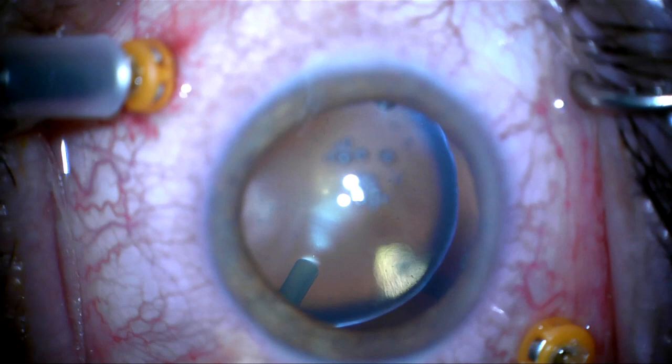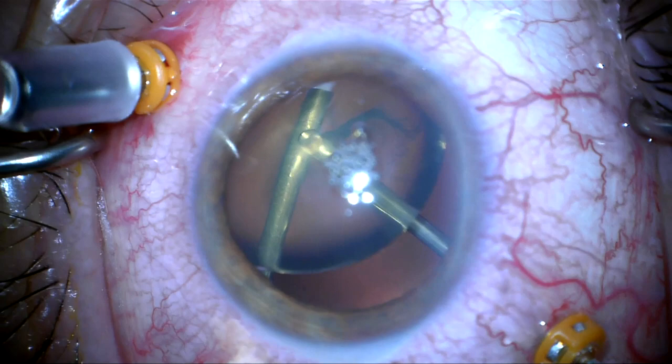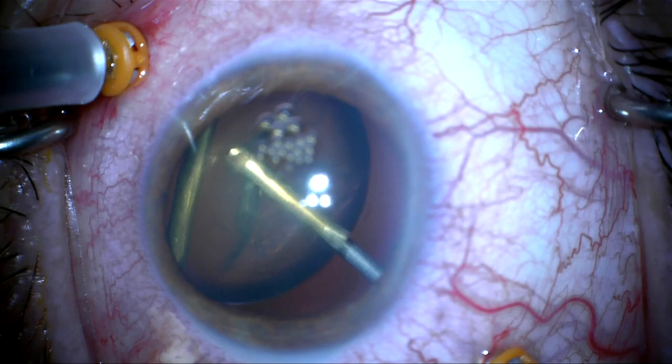I'm going to support the lens with the light pipe. After I've done a vitrectomy to remove all the vitreous in this region, I'm going to switch to vitfrag mode, which is higher suction and a slower cut rate. I'm going to use that to emulsify or vitrectomize this lens, which has about two-plus nuclear sclerosis.